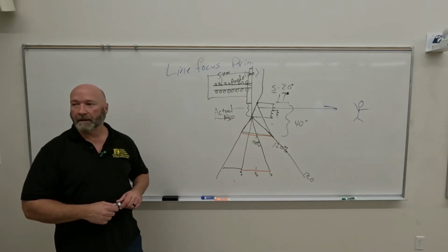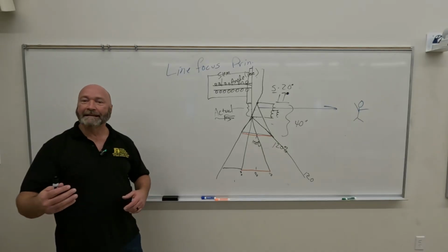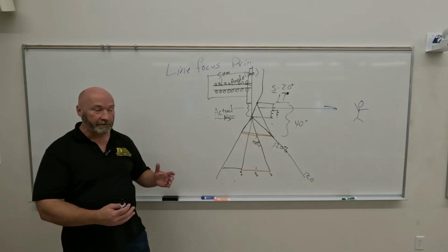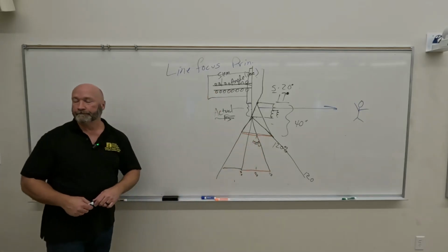At low. At low is bad, right? Yeah. You drop it down to 30 inches, it even gets worse. At 72 inches, how bad is it? Not as bad. Not as bad, right? Because you're using more of the middle of the X-ray beam, so it's not as bad.